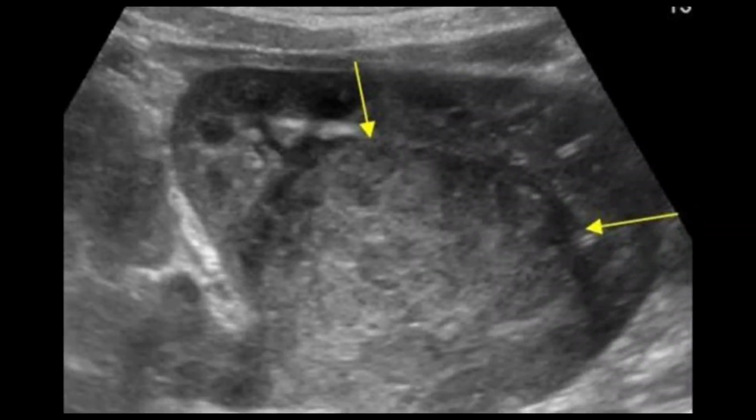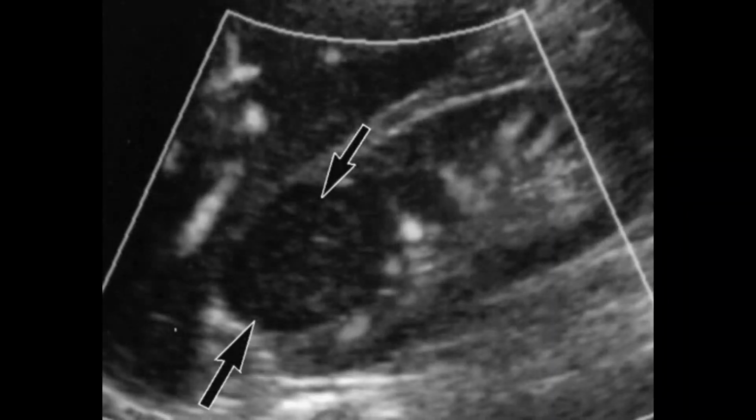The second thing is slightly irregular margins. So far as the parenchyma is concerned, it is heterogeneous parenchyma. However, cystic or necrotic changes are not clearly visible. There might be hemorrhage, but you have to pay attention, which will appear as small cystic areas, or there may be a slight debris within it if there has been any hemorrhage.